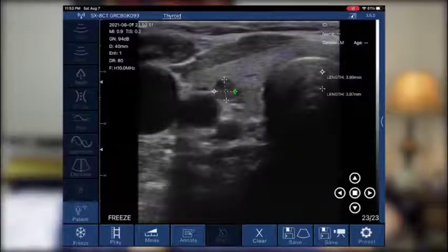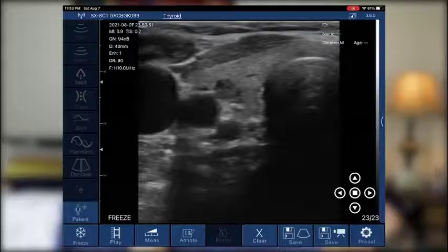One thing that I really like about that is that when I'm tapping, it's tapping exactly where I'm putting my finger down. It's not inserting the cursor to the left or to the right. It's pretty accurate. And I think that's great because that is one of the things that frustrates me sometimes when I'm measuring and I don't want to spend a lot of time fine-tuning my measurements.